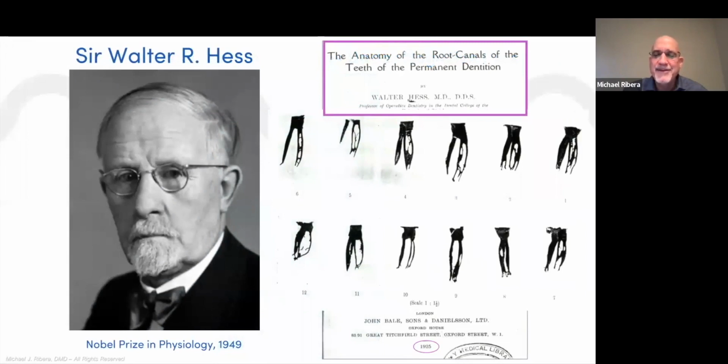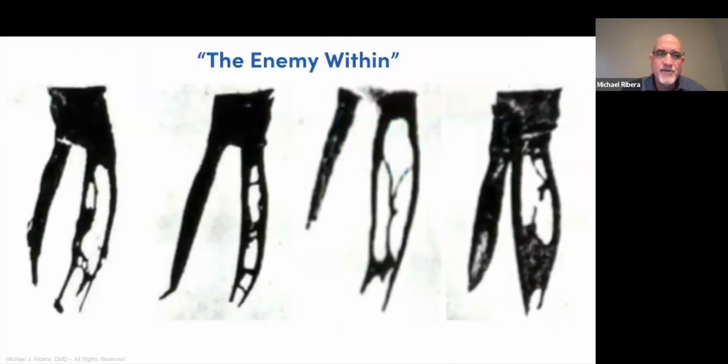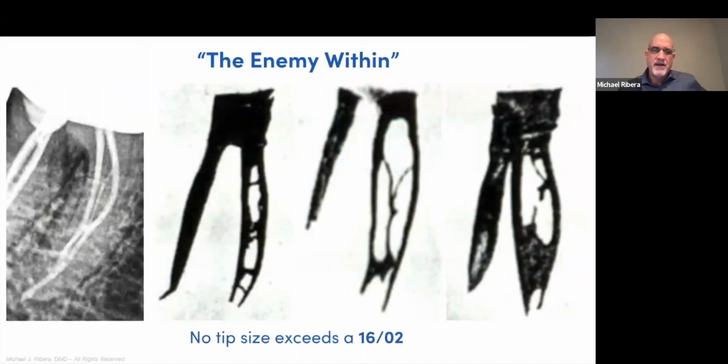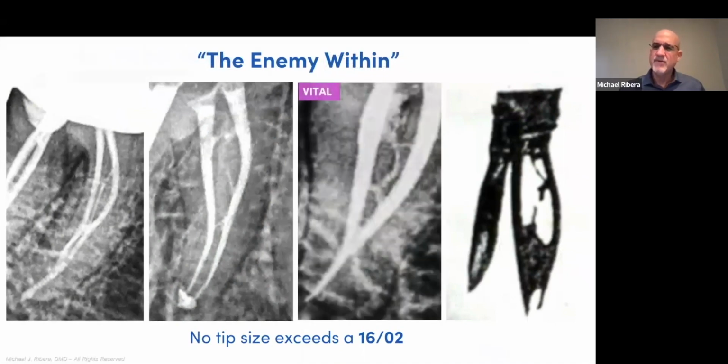Let's go back to this one page where Hess exhibited what he saw. He has these teeth categorized, what he saw within the main canals of the mesial canals of a lower molar. Let's focus on the four specimens, if you will, on the upper left. We have them here zoomed. For the first time and fairly routinely, we are seeing in the operatory what Hess saw in his laboratory bench: the areas of confluent isthmi, these loops, maybe middle mesials and anastomoses. This is what we're seeing now.